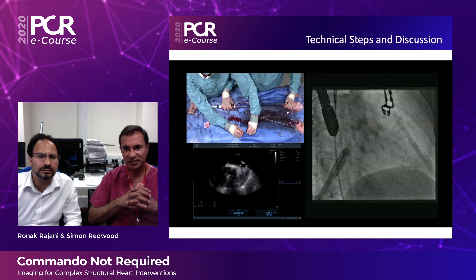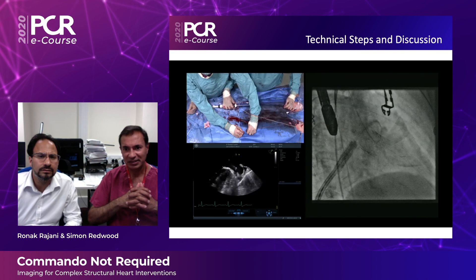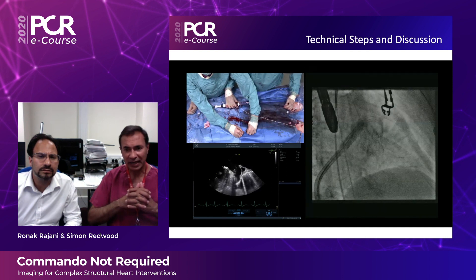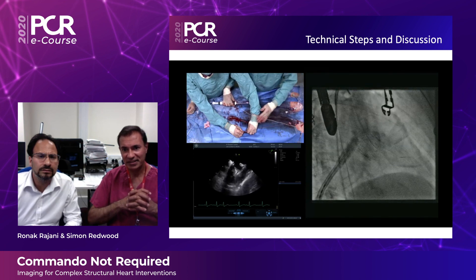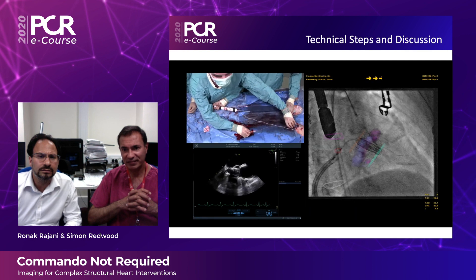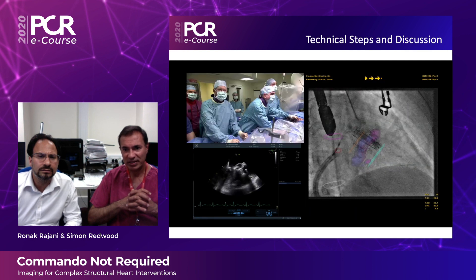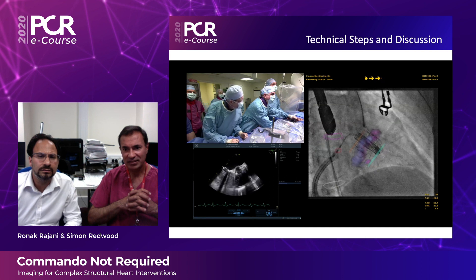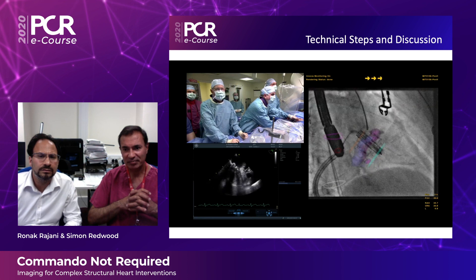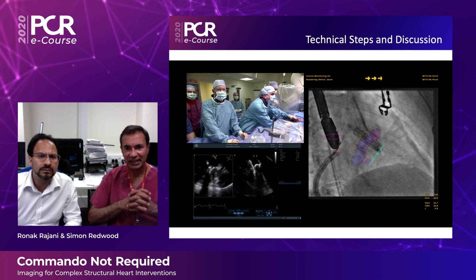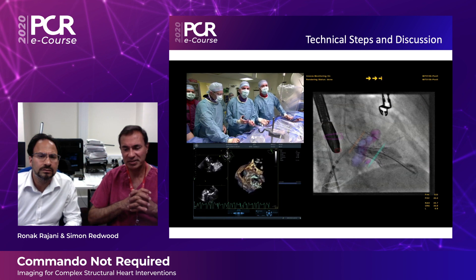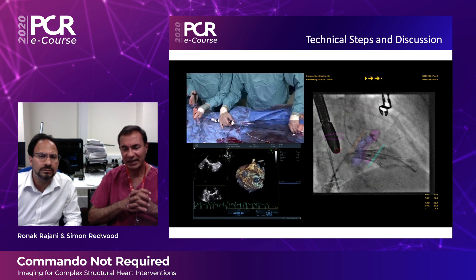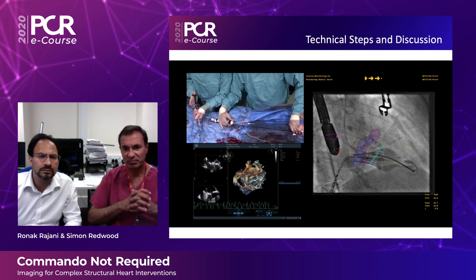You'll soon see it point downwards through the MAC. There it is in position — we've now turned on the image fusion and you can see that's a pretty good position of the valve. We're checking with transesophageal echo and have pushed the safari wire back into the ventricle. Here we are doing a slow deployment using pacing at about 120 beats per minute to try to minimize movement of the valve, and we've also suspended ventilation during valve deployment.